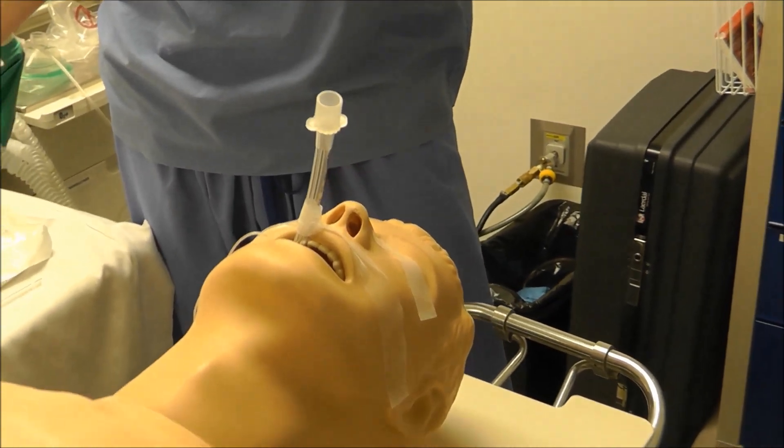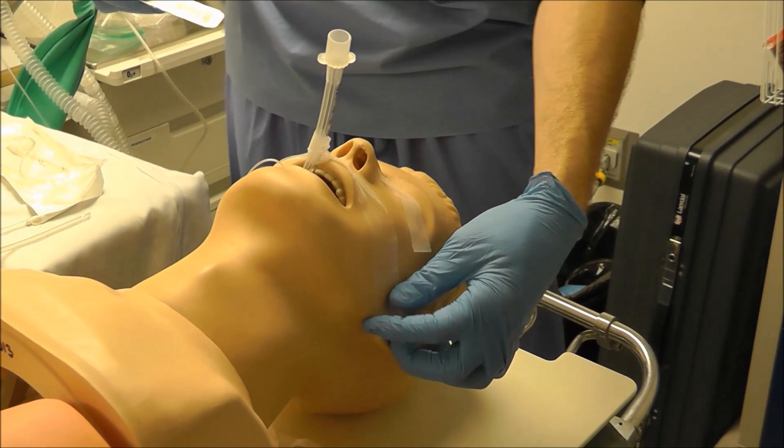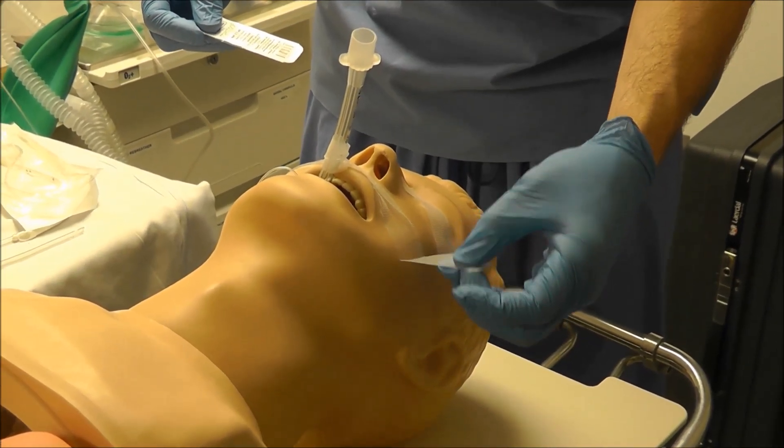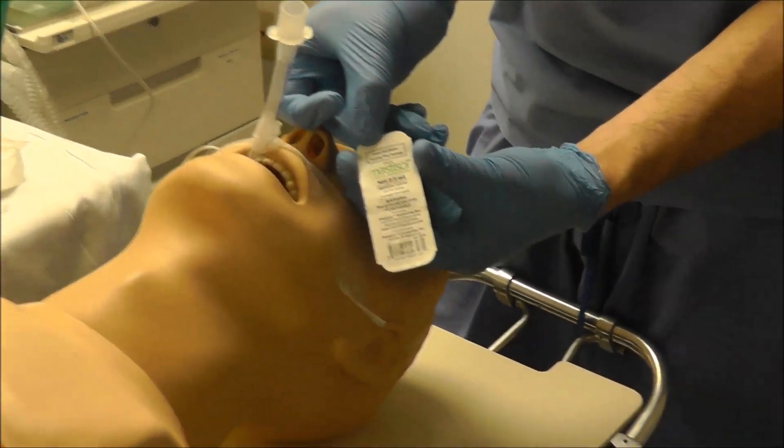Now if someone's got a big sweaty beard or a sweaty face to where this tape is not going to stick, we need to find a way to get our tape to stick to the patient's face. And that's where this comes in — we can use something called Mastisol.